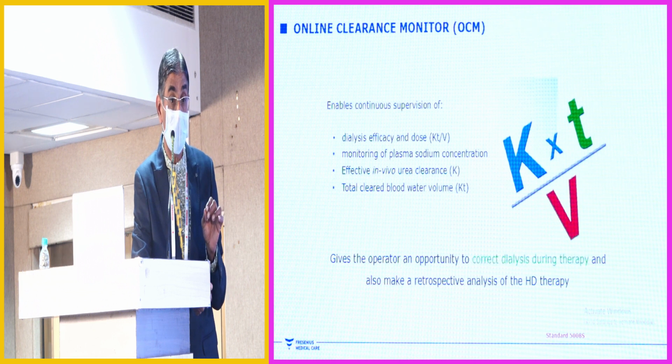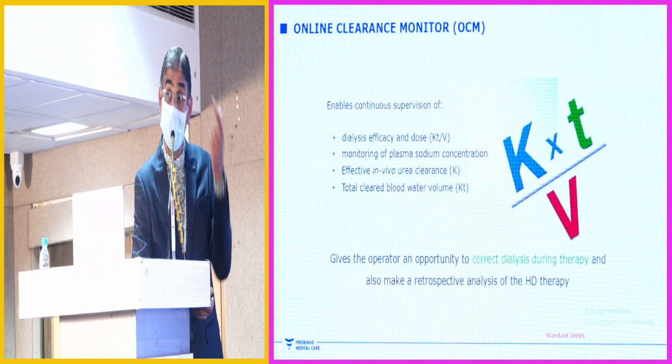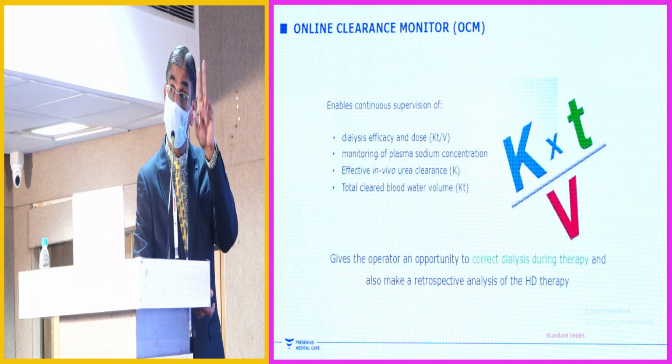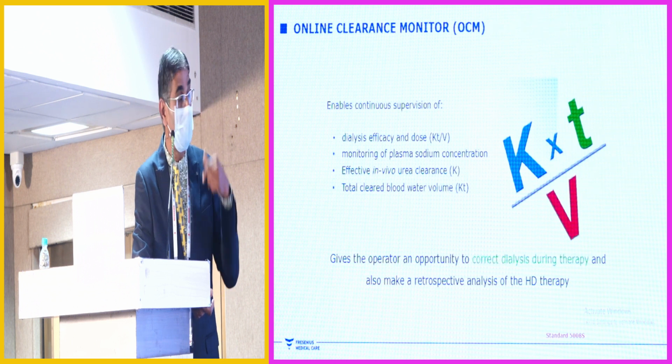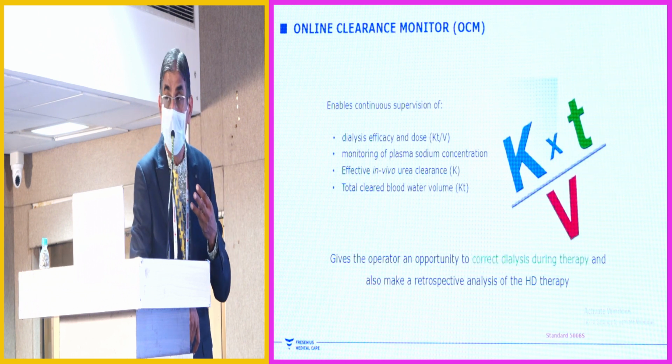That means, what I'm trying to say, even with your hemodialysis system, you can know whether the patient is malnourished. Why malnutrition? Because of inflammation. And the second reason, whether it's an access recirculation. Third, you can also know the plasma sodium.